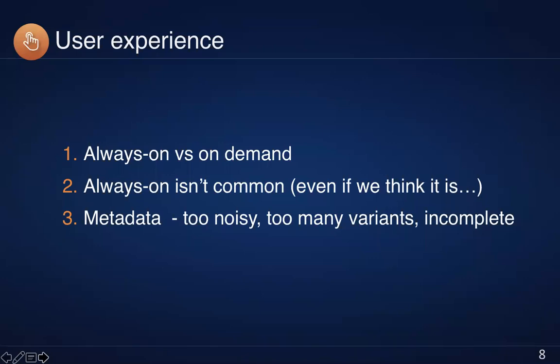And when we dug deeper into that, we noticed that it's not because of a user preference, but because the user actually provides a lot of context for the machine in order for it to know what to analyze. So the big question of what exactly the AI should analyze apparently is a very, very difficult question.